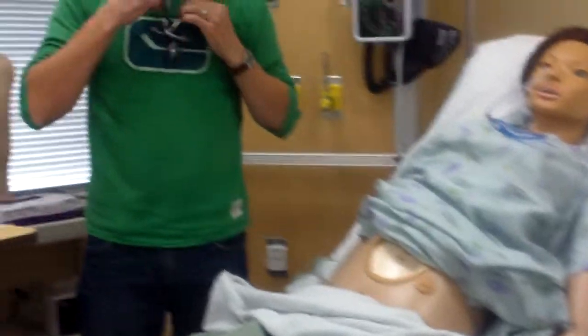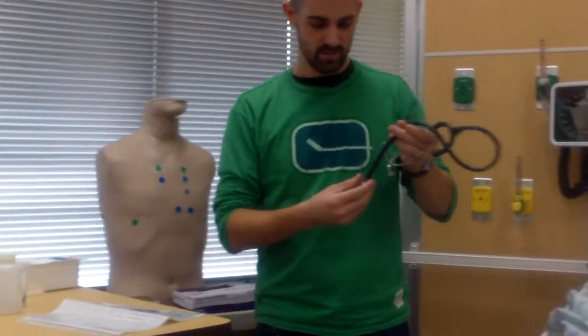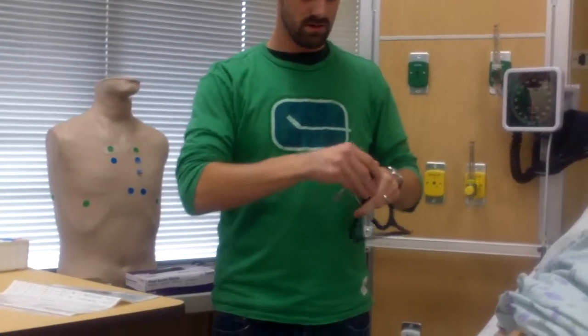So then after that, I would go through with some auscultation. I would clean my stethoscope.